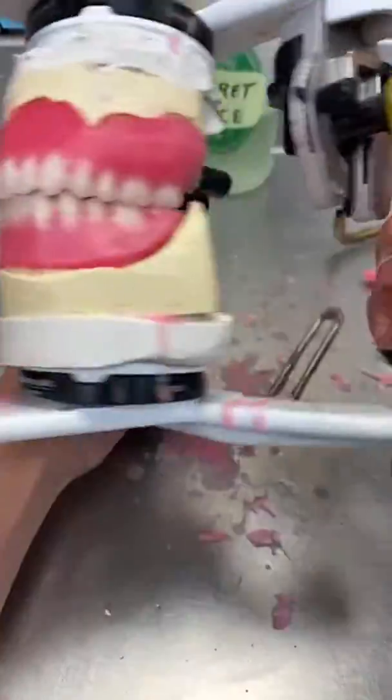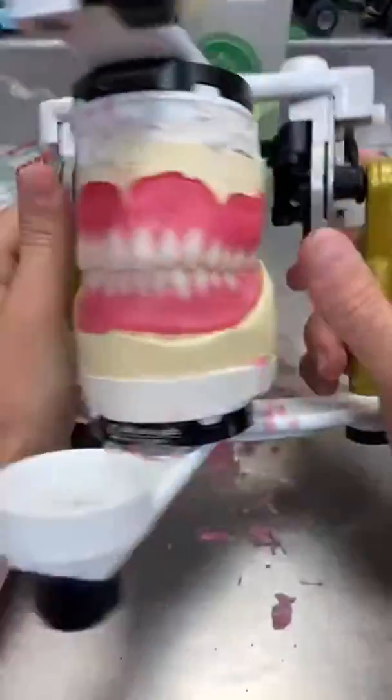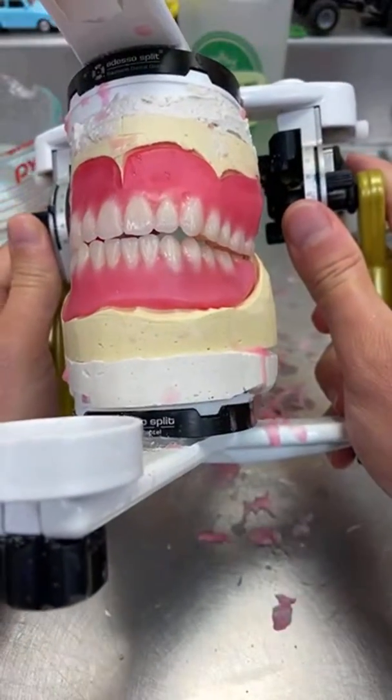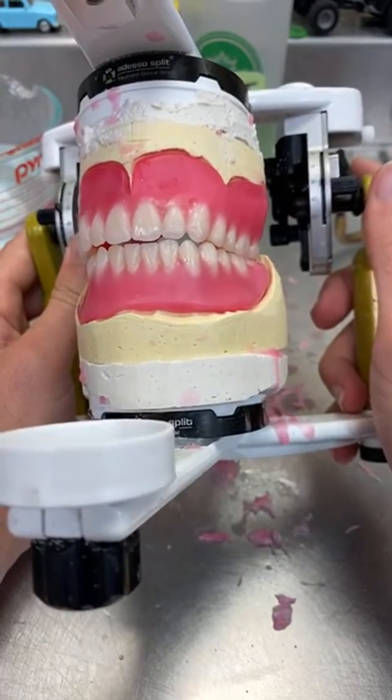So this is a semi-adjustable articulator that has all the settings, and you want to do it lateral. That's one side. Now balance and working.